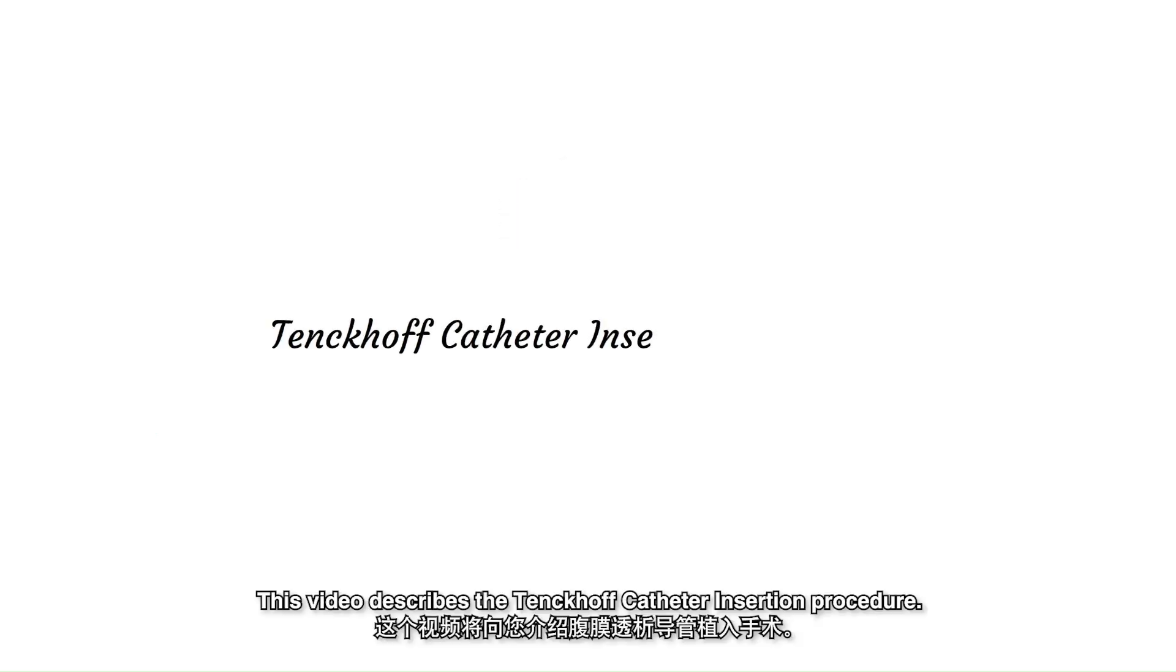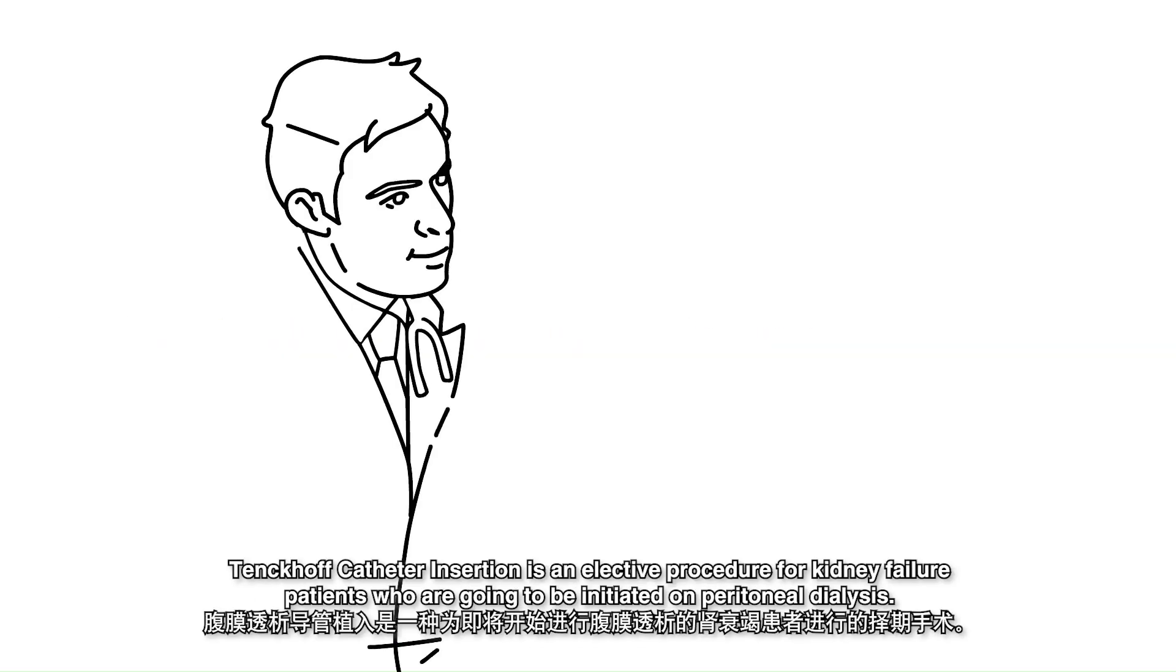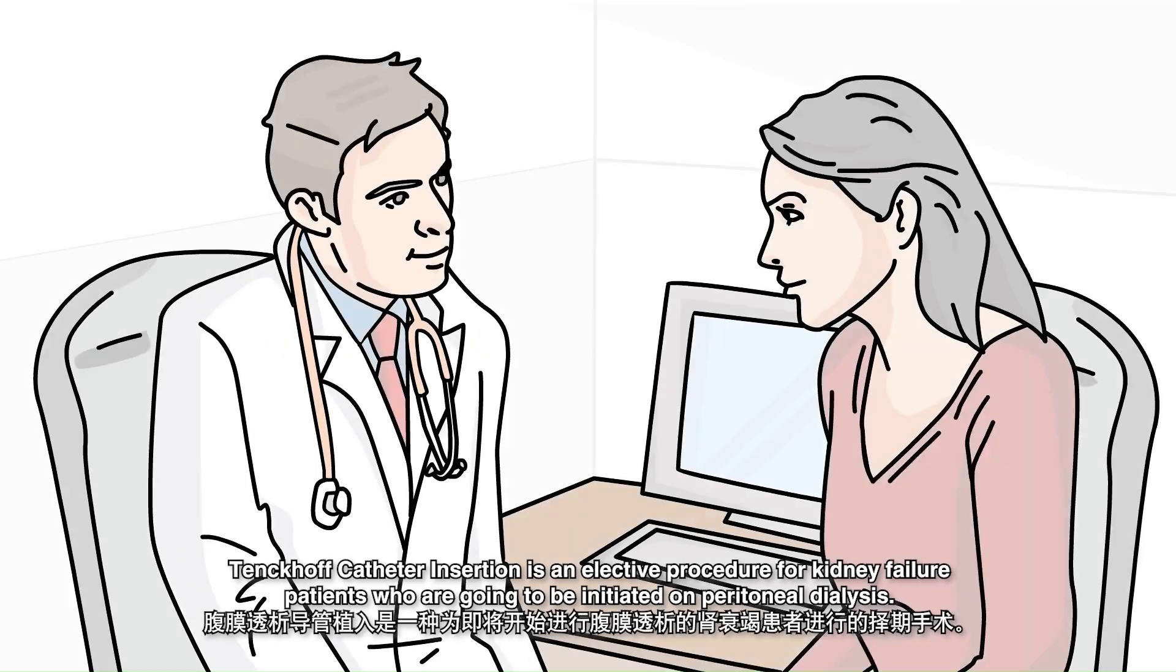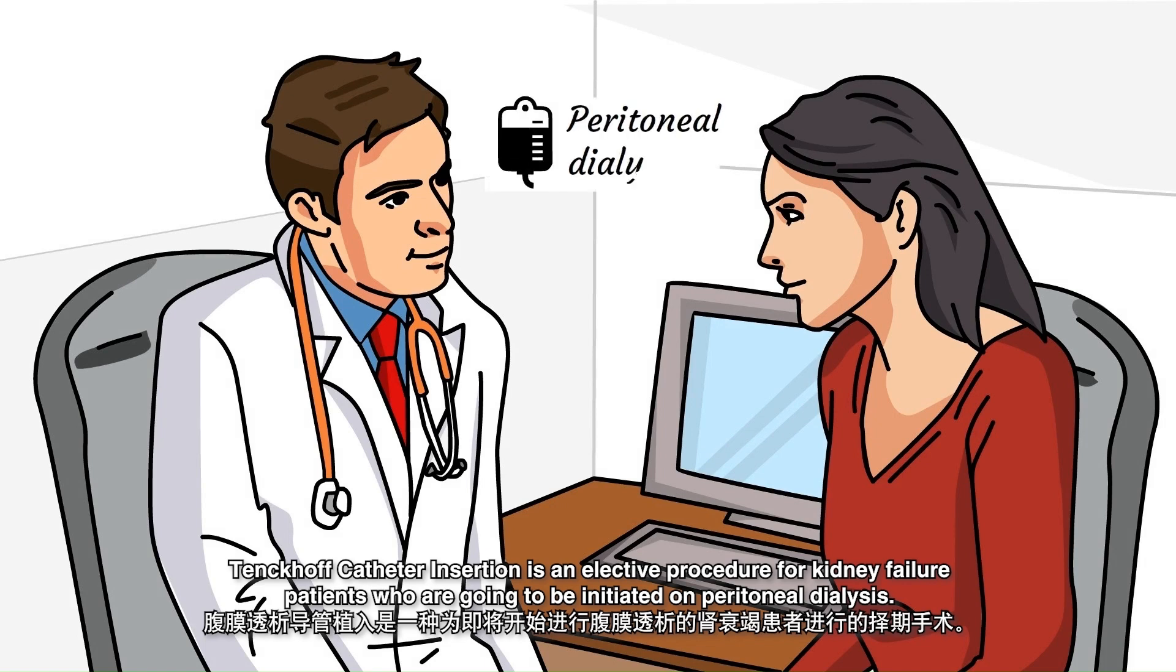This video describes the Tenckhoff catheter insertion procedure. Tenckhoff catheter insertion is an elective procedure for kidney failure patients who are going to be initiated on peritoneal dialysis.